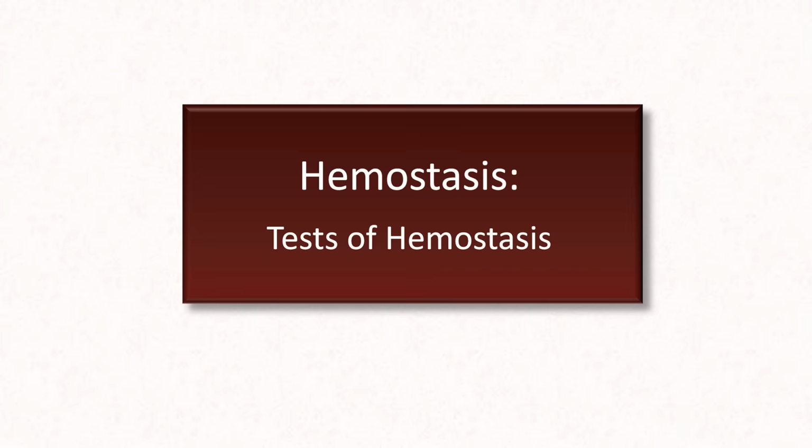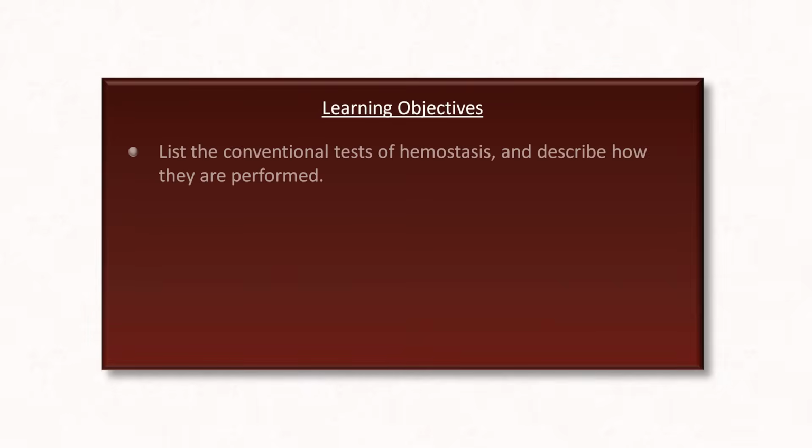This is the fourth video in this series on hemostasis, and today I'll be discussing tests of hemostasis. The learning objectives are first, to list the conventional tests of hemostasis and to describe how they are performed. These will include the platelet count, PT, and PTT.